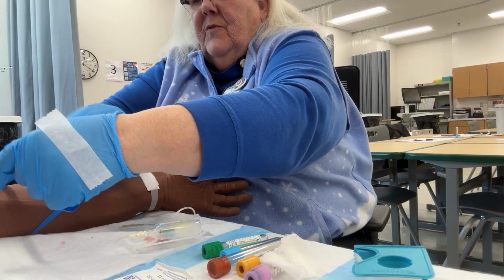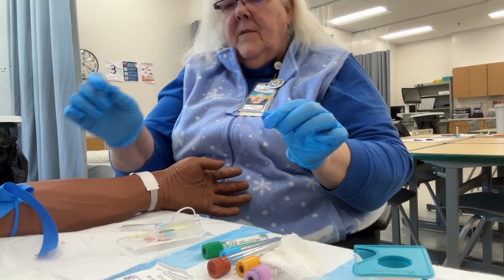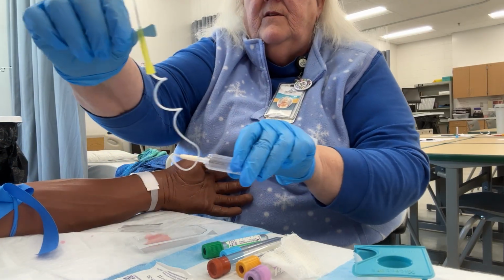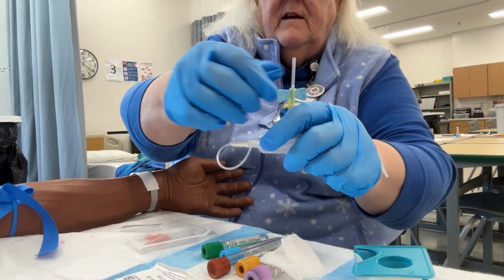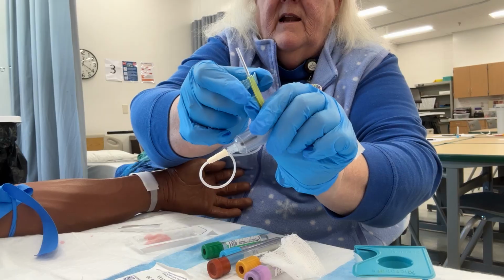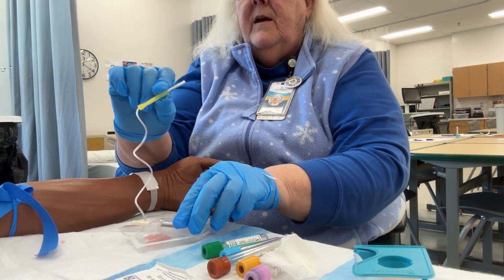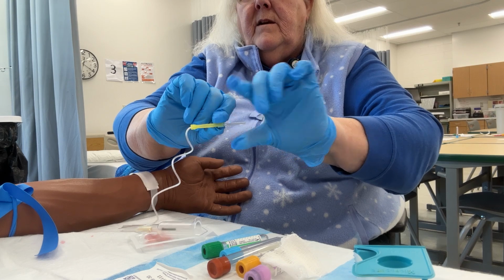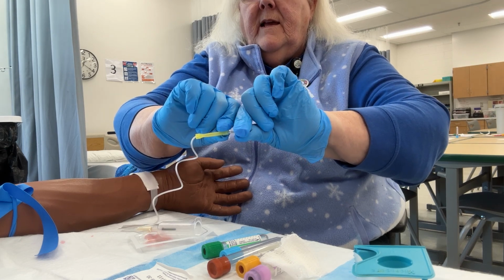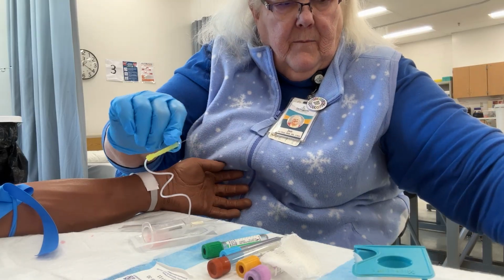Cross. The one that's in the front is the one that I tuck. Okay? I'm going to pick up my needle, and you'll see that there are bumps and no bumps. I want this bumpy side to be by my fingers because that gives a good grip. I take the needle cover with big hands and I pull. You want to just pull with big hands so you don't get a bounce back.